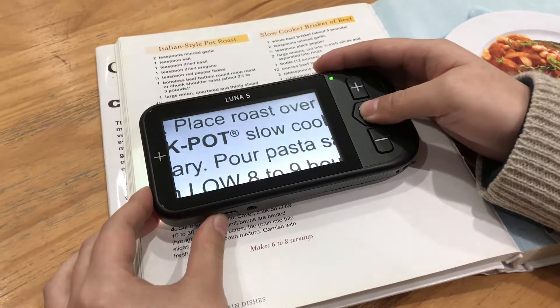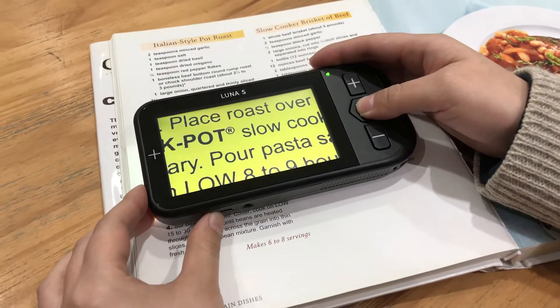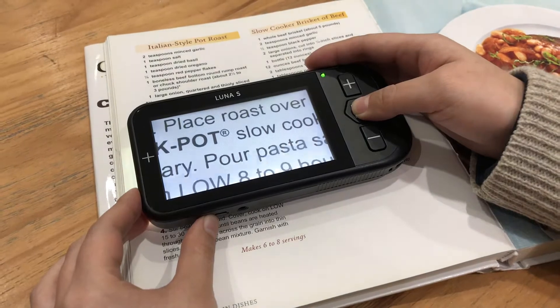Press the mode button to change color modes. There are 10 color modes: true color, grayscale, and 8 high contrast colors.